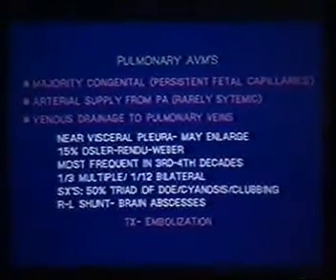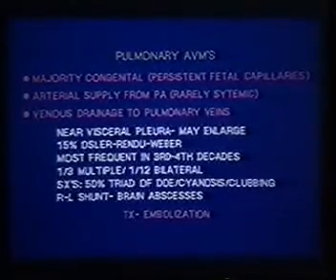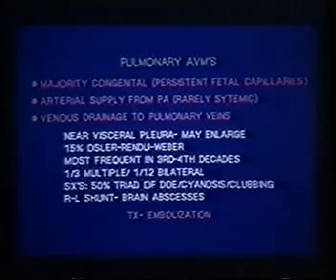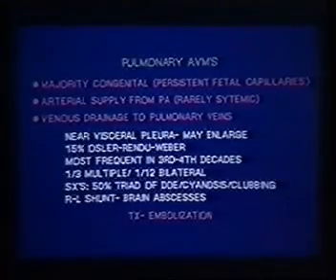Well, what about vessels? And let's spend one more second in terms of our spectrum. Now, we've worked our way from anomalies of the architecture of the lung unassociated with abnormalities or anomalies of vessels to the other end of the spectrum, where the lung is normal, but we have anomalies of the pulmonary vessels. And AVMs, I think, are a reasonable diagnostic dilemma for us. We think about them a lot. It's amazing how often both my residents and my peers will look at a radiograph and say, well, maybe that's an AVM. It's amazing how rare it really turns out to be.